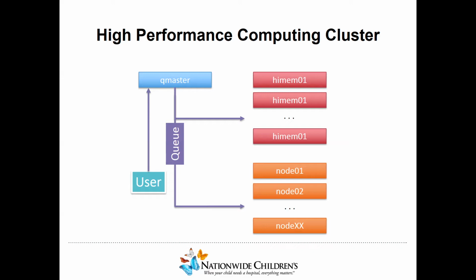A task that would take 5 hours, if we did that serially, for 10 subjects would be 50 hours. With the computing cluster, we're able to start them all at the same time in parallel, and that allows us to spend 5 hours running 10 jobs, and we've run 10 subjects.